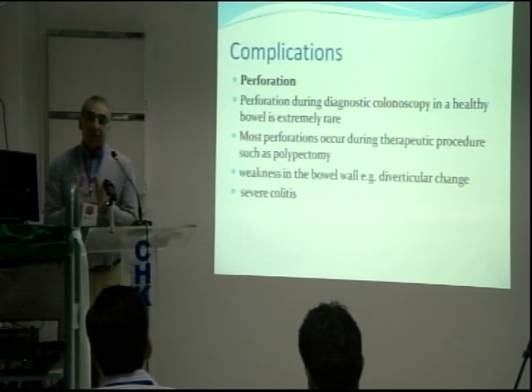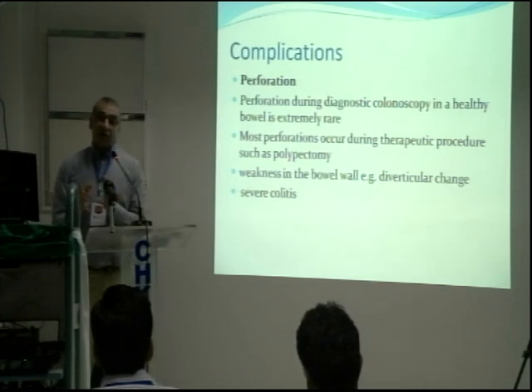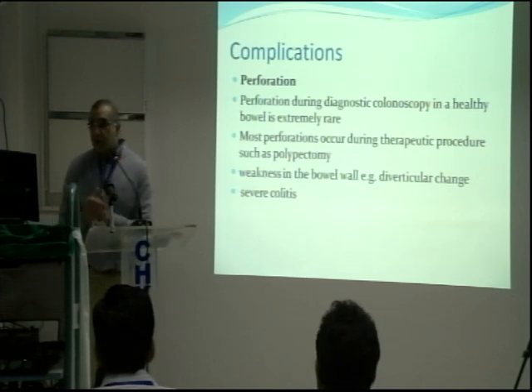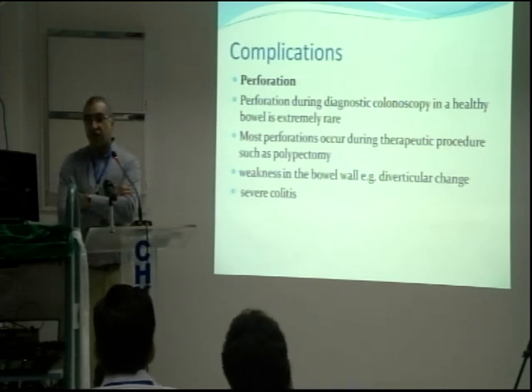Now coming to the complication of perforation, in a diagnostic colonoscopy it is almost unheard of, very negligible, hardly ever. It shouldn't occur in a diagnostic colonoscopy, because if it does, that means you are doing it very badly. Perforation occurs during therapeutic procedures. In a diagnostic procedure it means you are very rough or your technique is rubbish, right? So that only occurs if you are carrying out polypectomies or putting stents in or doing dilatation, then that's fine. That's a recognized complication.